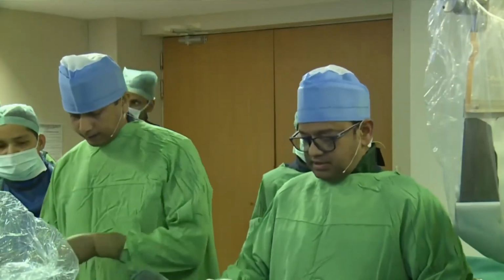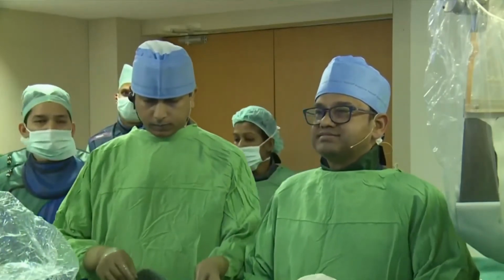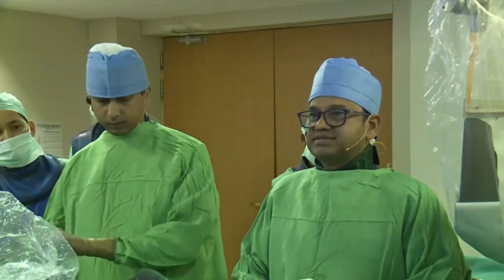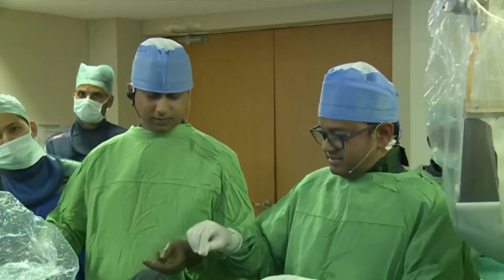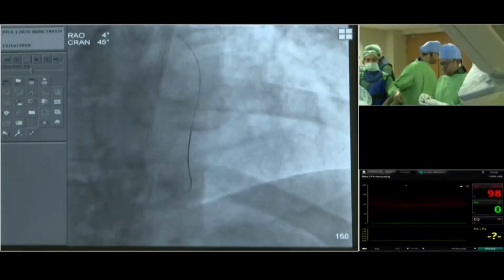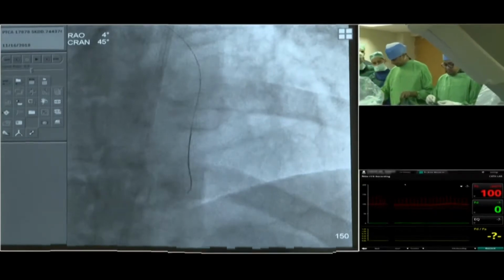While we are getting it in, how many of you end up all the interventions with FFR? We don't routinely do it because the results are so dissatisfying. We'd rather not know. Yes, I think we're starting to look at that a little bit more in certain cases, especially when we're surprised about physiologic lesions, especially intermediate disease.